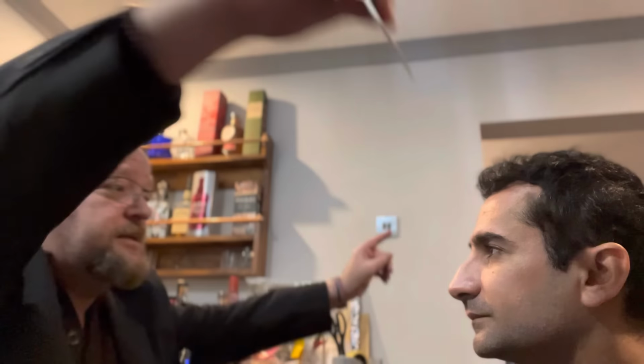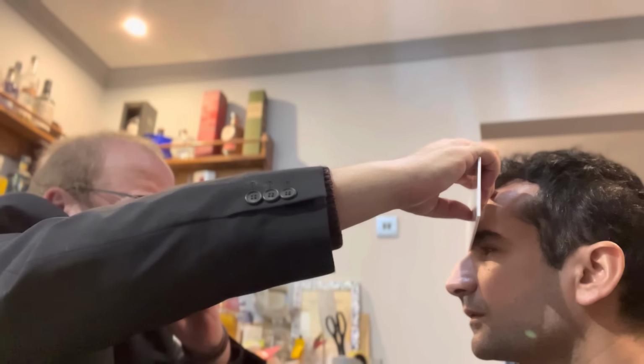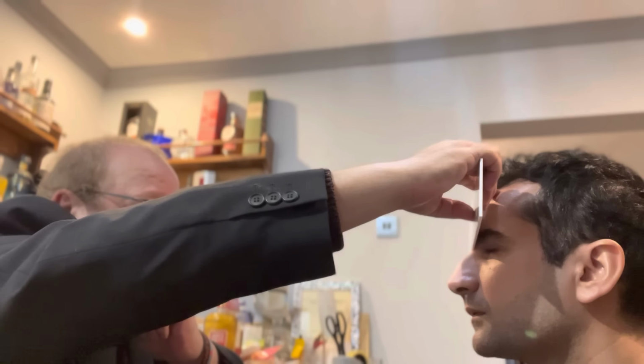Now I'm going to measure your pupil distance, and I'm going to do mono PDs. Because of my experience, I don't need to use a mono PD ruler. If you look at my finger, I've now centred the naught straight on the centre of your pupil, and as you look across, I've got that as 64, but as I'm doing it as mono, that's 33 and 31, making it a total PD of 64.